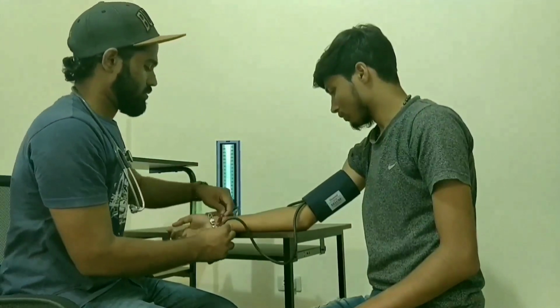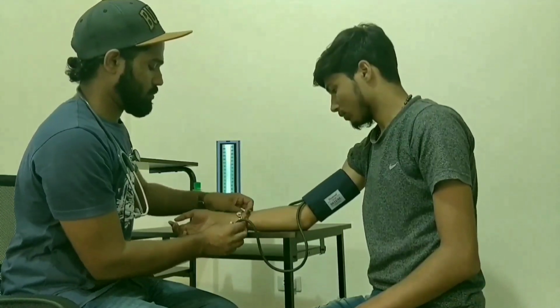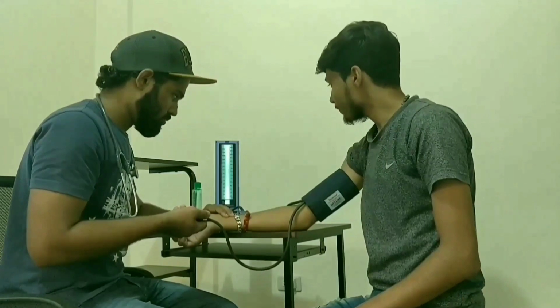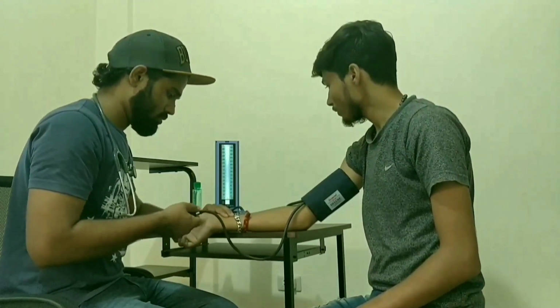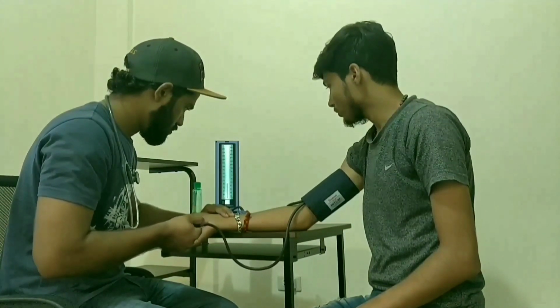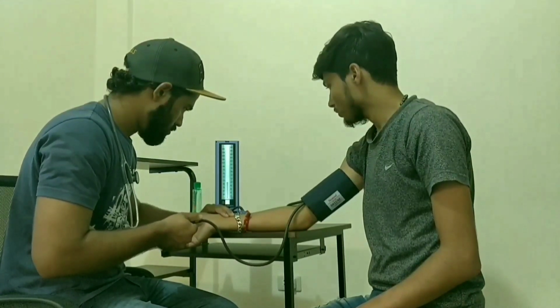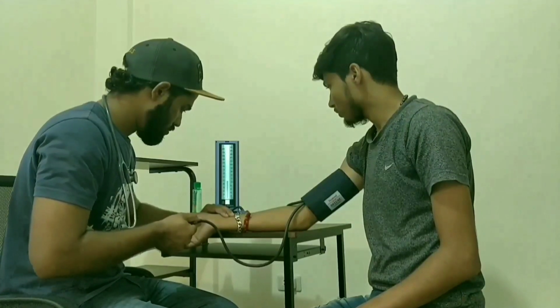And now you will check the radial pulse, and after feeling the radial pulse you will inflate the cuff, and after inflating the cuff, when the pulse disappears, you will note that point and again deflate the cuff.